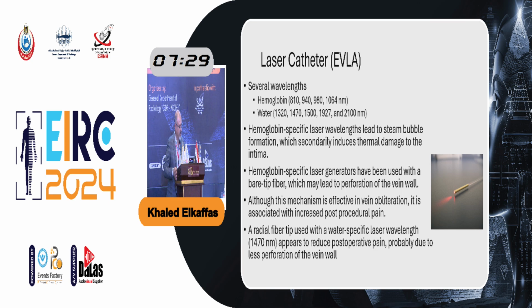The hemoglobin-specific laser wavelengths lead to steam bubble formation, which secondarily induces thermal damage to the intima. The hemoglobin-specific laser generation has been used with a bare tip fiber, the old fiber, which may lead to perforation of the vein. So although this mechanism is effective in vein obliteration, it's associated with increased post-procedural pain.